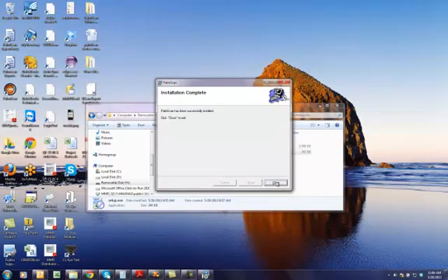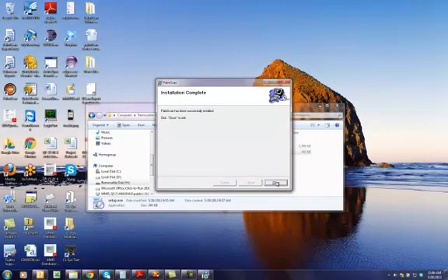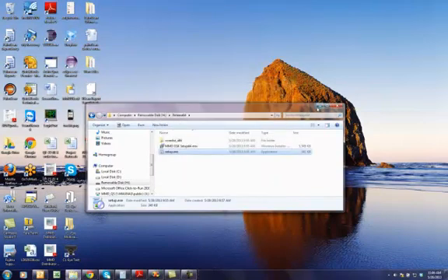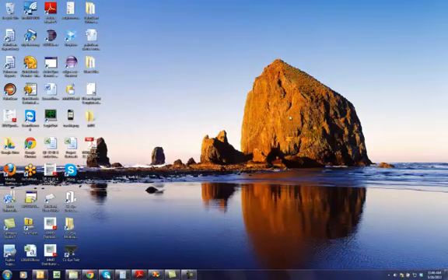Okay, installation is completed. I am going to close the install here. And on your desktop, now you should have a Palm Scan icon.